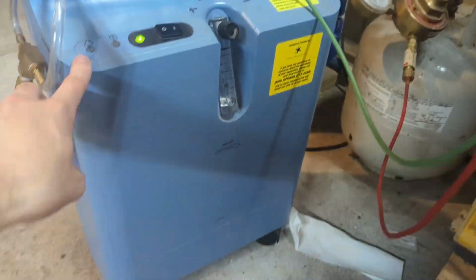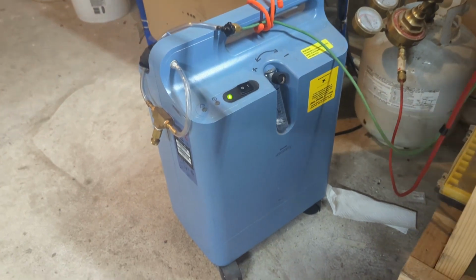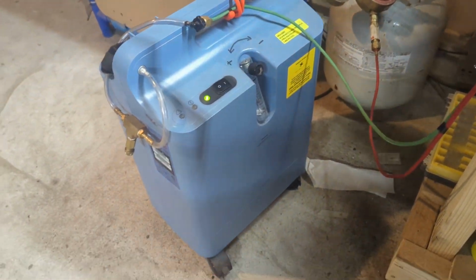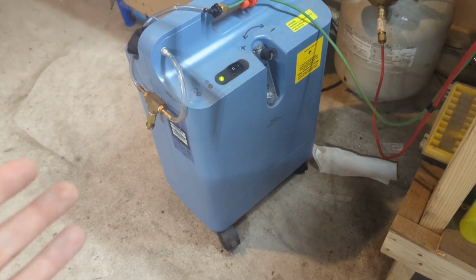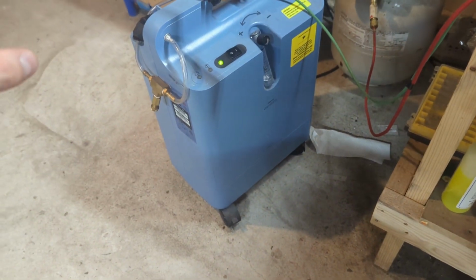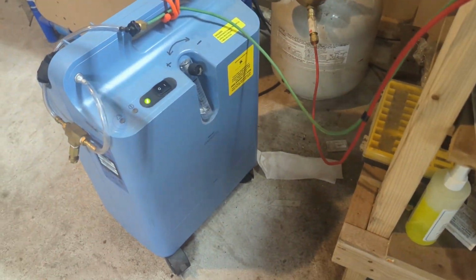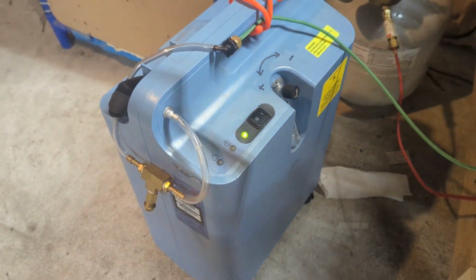So this is the Philips Respironics concentrator. Obviously, it's a medical item for medical purposes. It's made for old people pretty much to breathe, and it's made for a continuous cycle. It's not meant to hold up pressure for extended periods of time. How it runs is it sieves air through sieve beds, or really sieve tubes, and when it holds pressure, it backs up the system and it doesn't work, and it will set off an alarm telling you that it's bad for it, and it's just a very loud alarm.